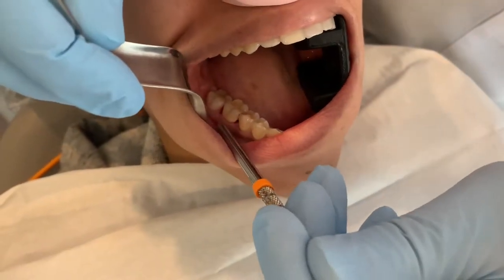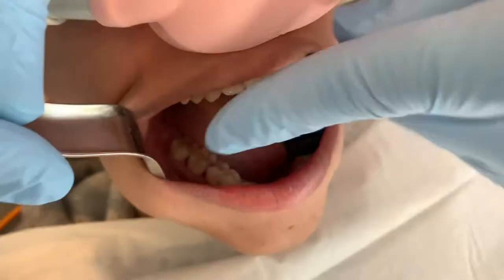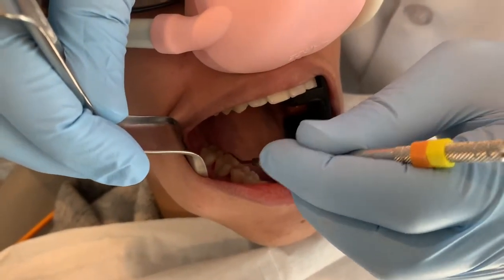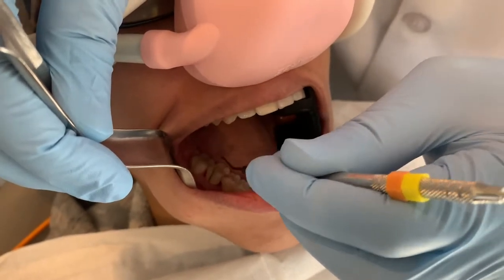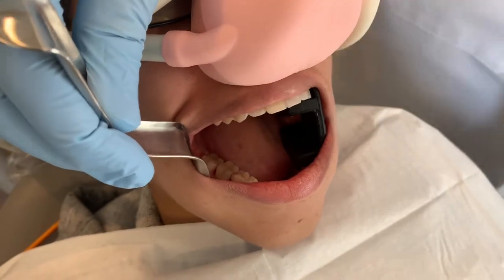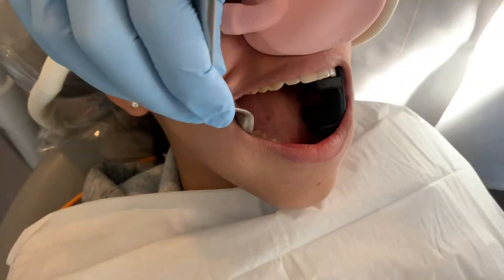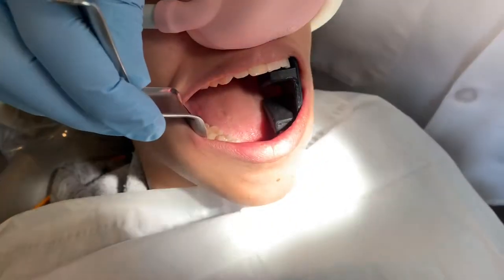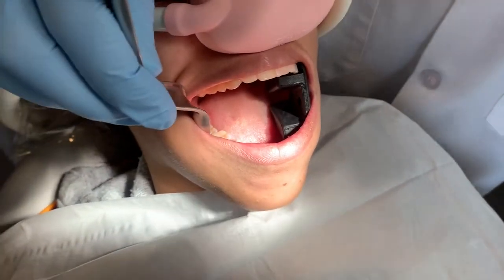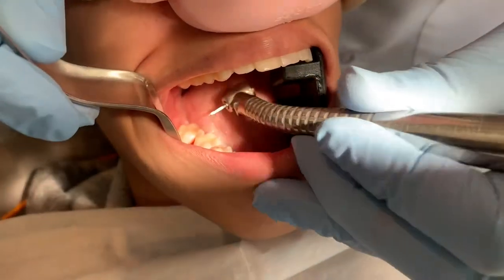Since this tooth has two roots that kind of look like this, I'm going to separate the tooth into two pieces, and I'm going to cut it front to back here. And then we can easily take it out like two splinters rather than trying to pull it out in one big piece, which would be much more traumatic. I'm going to go ahead and turn the suction on right now, so you're not really going to be able to hear as much what I'm saying. And I'll put my mask on, get ready to go. All right, suction.